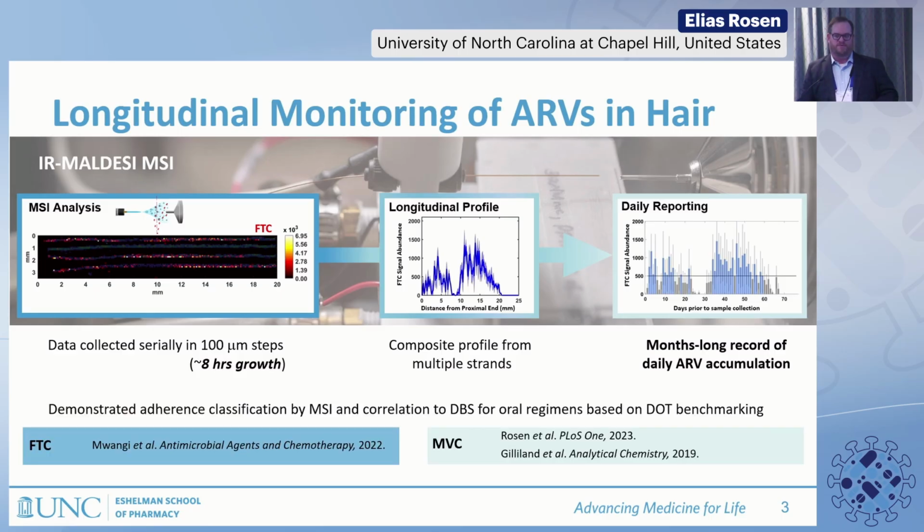And we have demonstrated the ability to use this mass spec imaging approach for adherence classification, as well as correlation to dried blood spot analyses for oral regimens using directly observed therapy benchmarking, which we've published on for emtricitabine as well as Maraviroc.